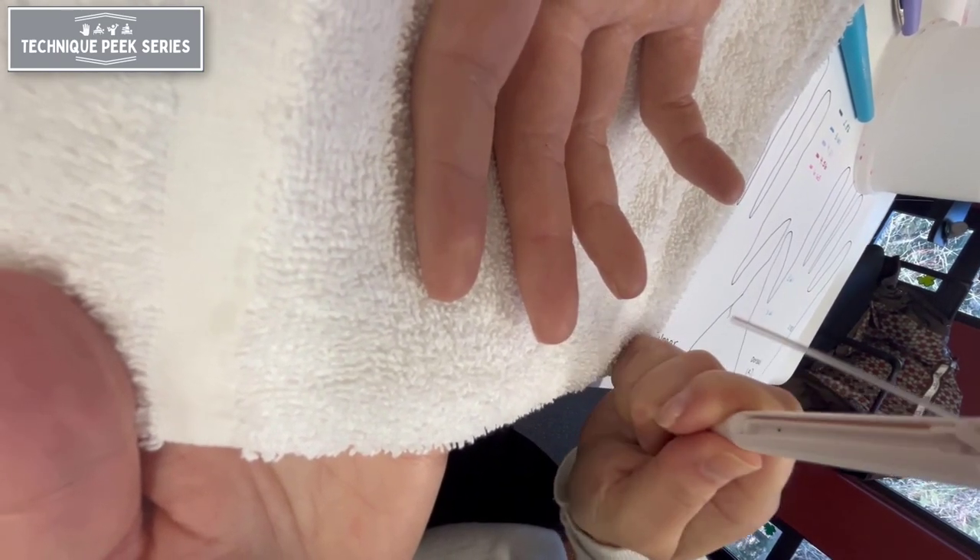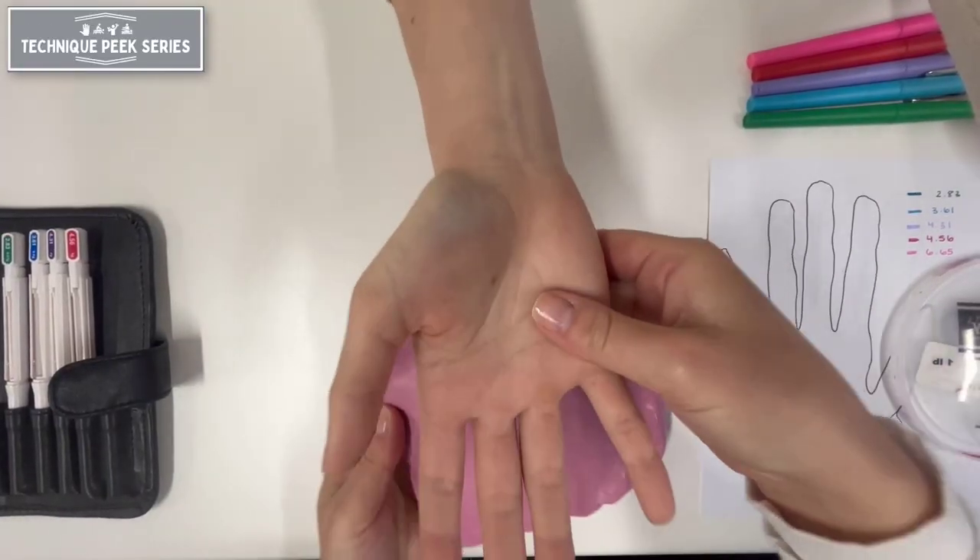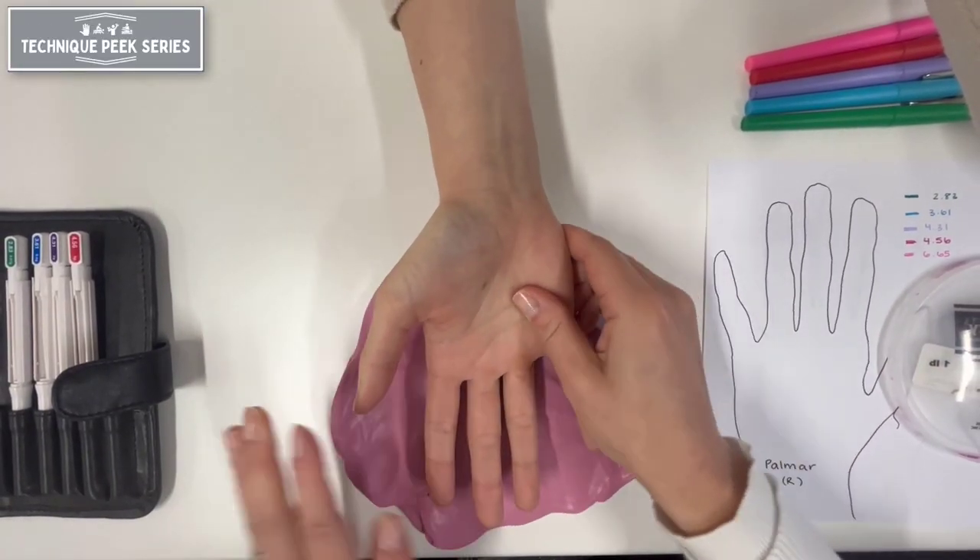When properly supported on a towel or putty, you can apply pressure with the monofilament and no movement of the finger is noted.